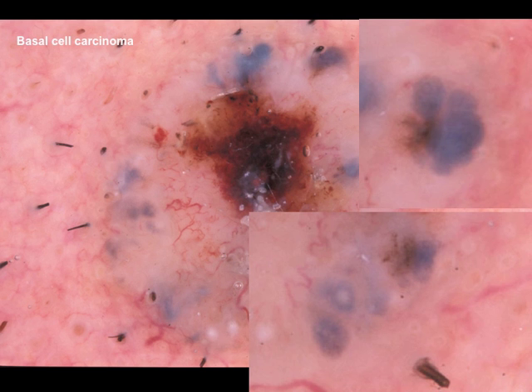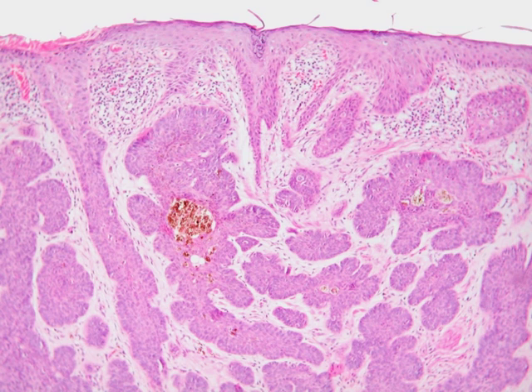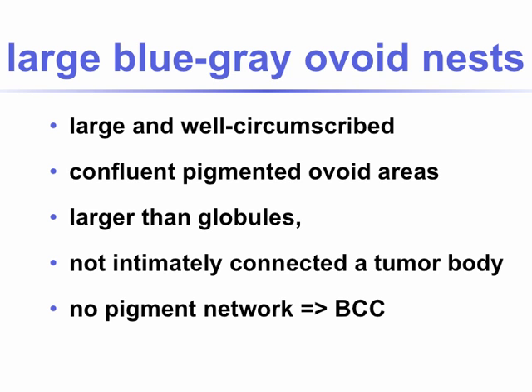Again at higher power, these leaf-like, blue-gray areas. Histopathologically, one can see these pigmented tumor nests, explaining very nicely this leaf-like pattern.